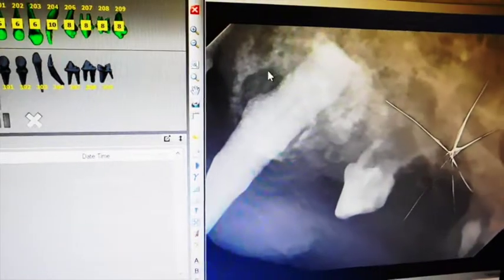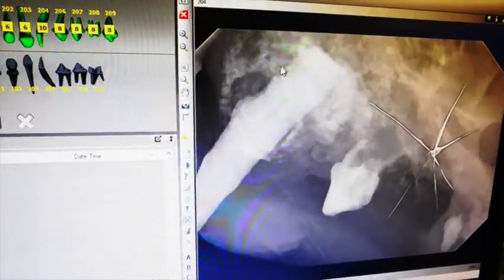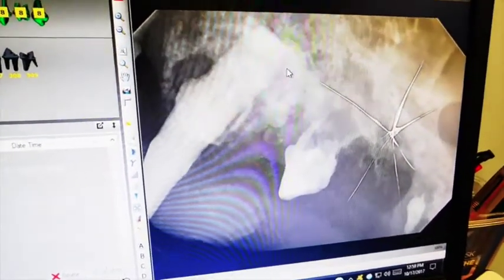Here is the root, and we can see this black bubble which indicates periodontal disease, and around the tip of the root, this appearance of the alveolar bone is also suggestive that this tooth is overdue to be extracted.